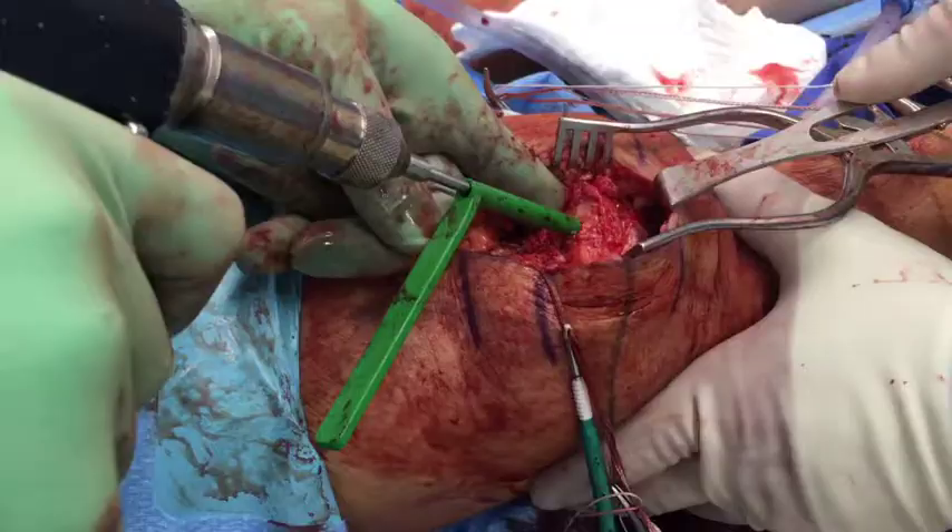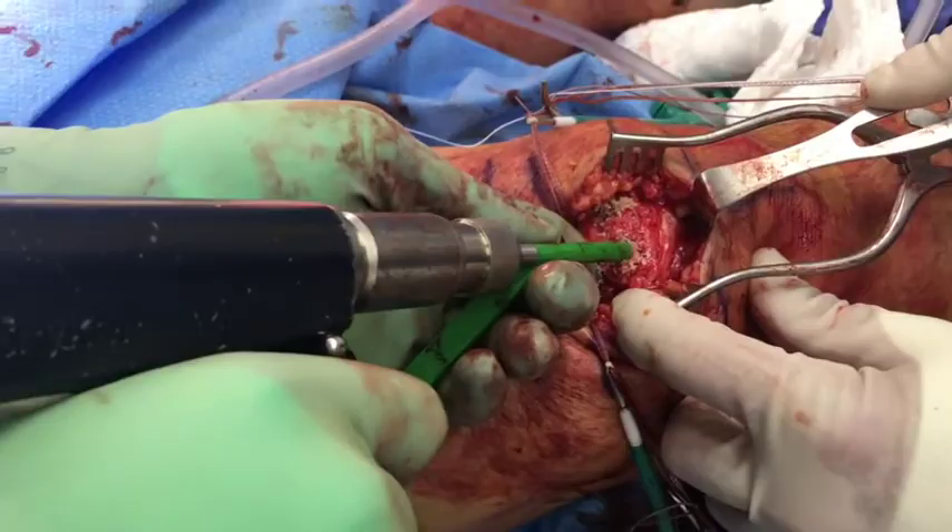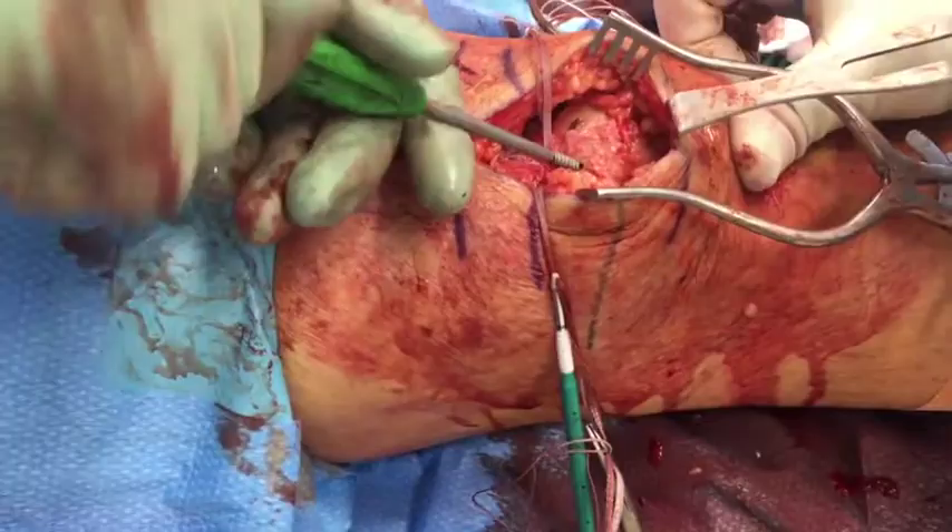The 3.5 millimeter drill bit is then advanced at each electrocautery mark. The surgeon should keep a finger on the articular surface for proprioceptive feedback to ensure that the drill is centralized within the patella and does not encroach on the articular surface. Debris is removed and the tap for the anchor is fully seated to the laser line within each hole.